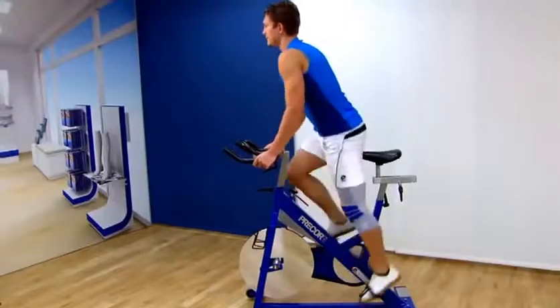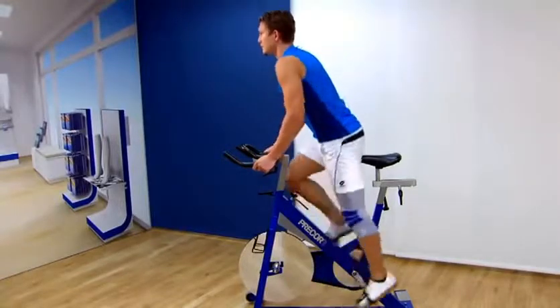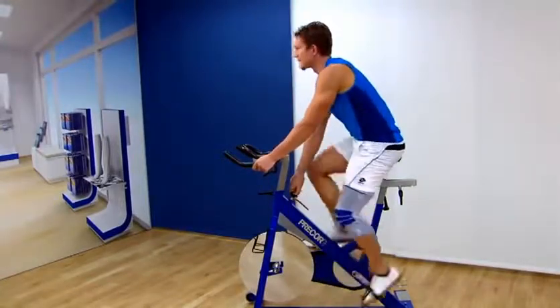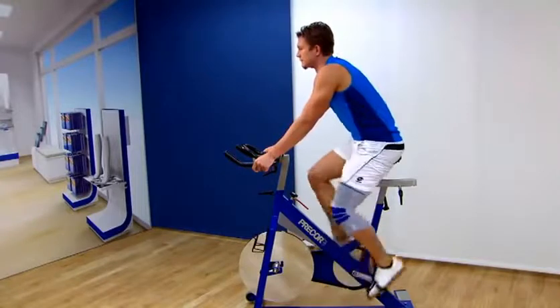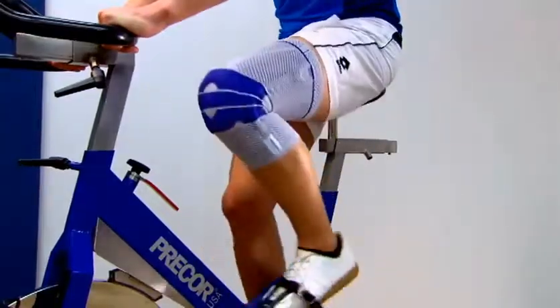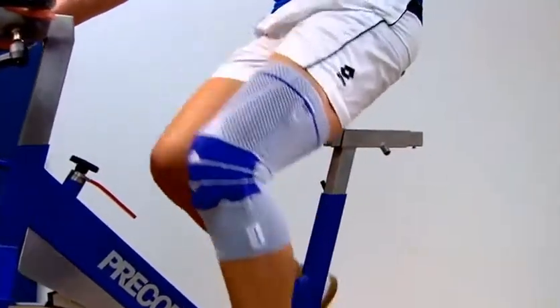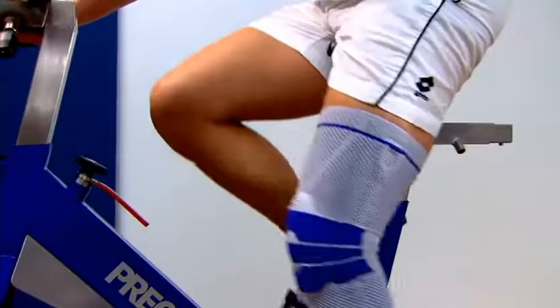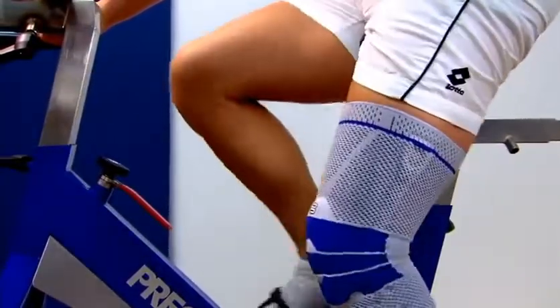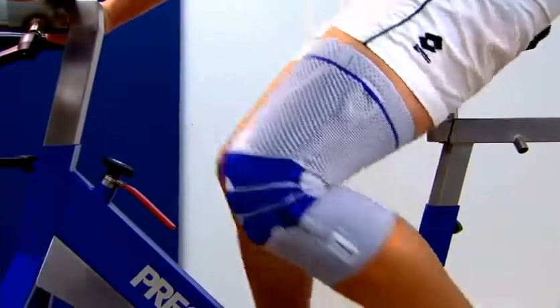The therapeutic effect of the active support is produced during movement. The Genutrain boosts the sensory motor system, which stabilizes the muscles in the knee joint and noticeably alleviates pain. It also helps to speed up lymphatic return circulation and reduce swelling more quickly. The Genutrain from Bauerfeind relieves and supports the knee joint for greater stability and mobility.